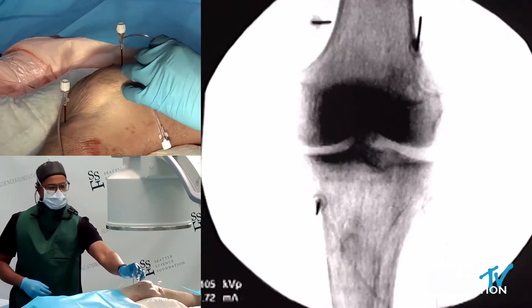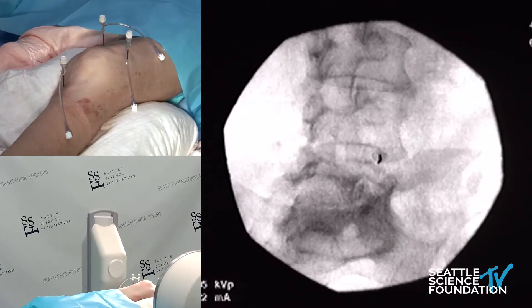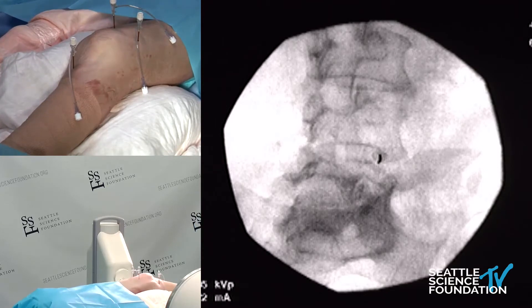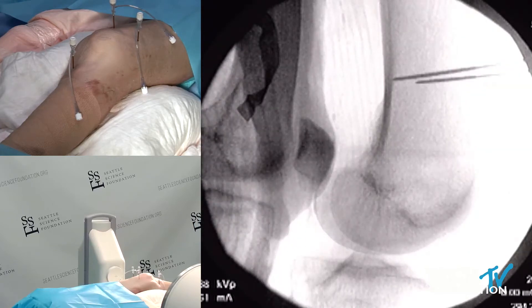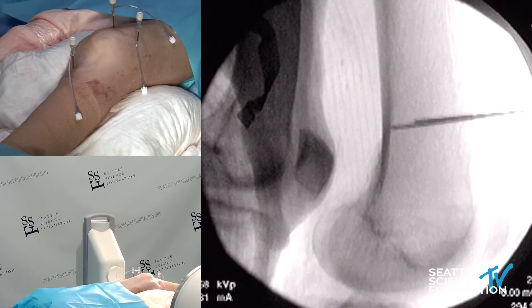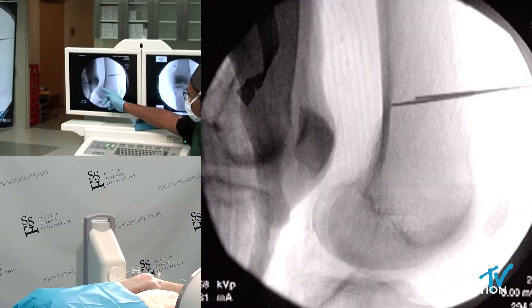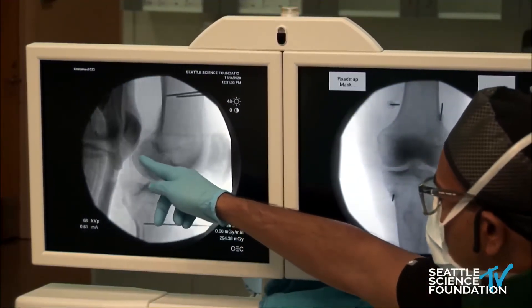I'll bring that to a little bit more inferior position. We propped up this left knee here with a little radiolucent pillow, which is nice because on the lateral you want to make sure you're looking at your target knee and not both knees. The other key thing here is to line up the epicondyles — making sure those condyles are lined up perfectly. We're doing a little wig-wag here to create an eclipse of the two femoral condyles. Our obliquity is perfect because you can see the distal aspect of the femur is fairly in line, but we need those condyles to cross over a little bit better.